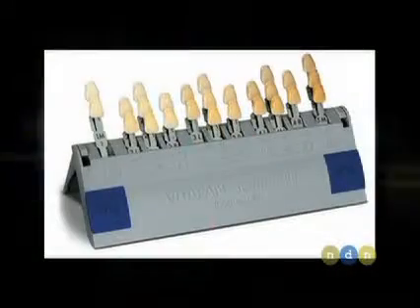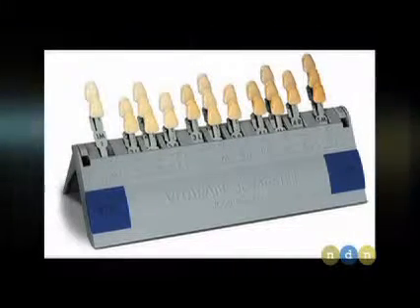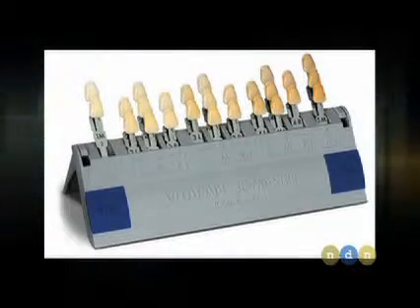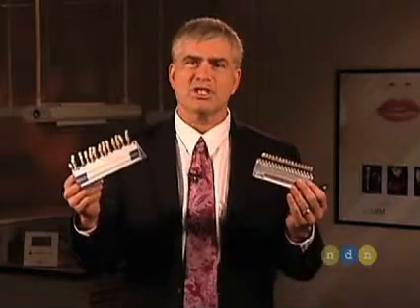In 1998, the same company that brought us this gave us the 3D Master Shade Guide. This shade guide gives us a larger number of choices. Not only that, it's designed and organized from value to chroma to hue, the very same ways that we should be using and adapting our eyes, our visual performance criteria for picking and selecting and matching shades in dentistry. It's really a value, chroma, and hue orientation that we want to approach with today. In fact, we're going to make a case for how this neat company is actually replacing its old product line, its old shade communication methodology with a new one, and how it's a more scientific, more evidence-based approach to that kind of utilization.